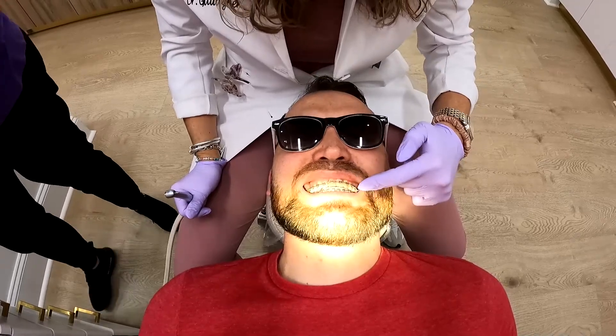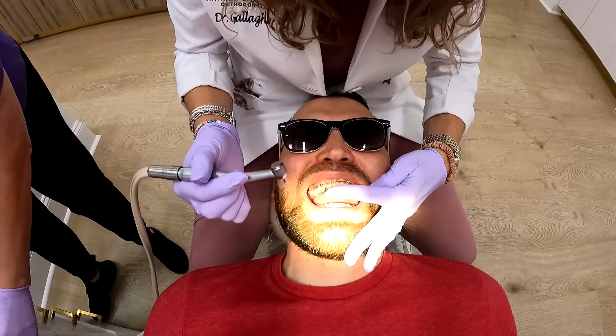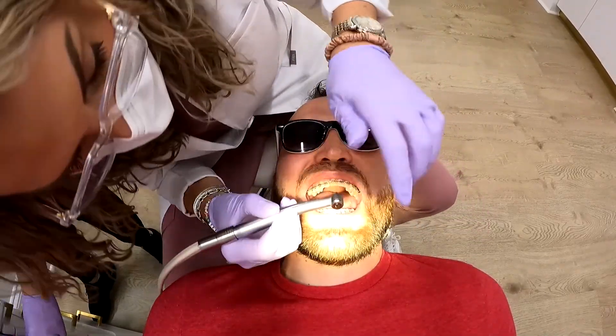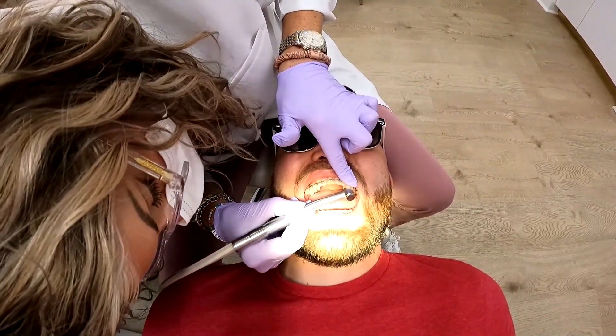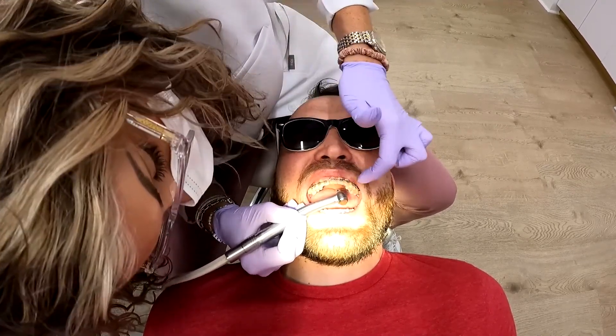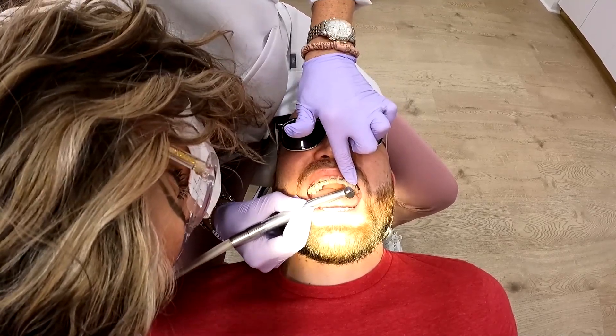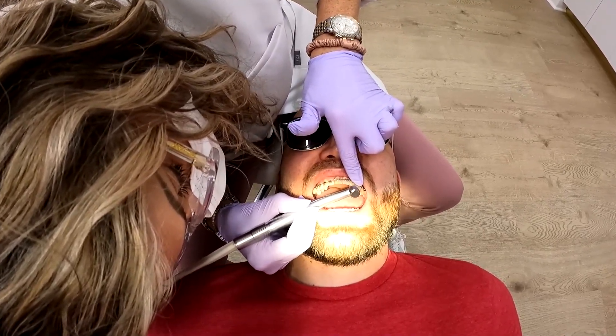Remind me — are you having implants done? No, you were going to refer me to something. Yeah, so I will do that today. Can you grab Dr. Sonata's card? Open for me again. We're just going to do a little polish on the backside because this tooth is thicker than the tooth that is supposed to be there — not unusual that we have to do this. You doing okay? Yeah. Same thing down here.